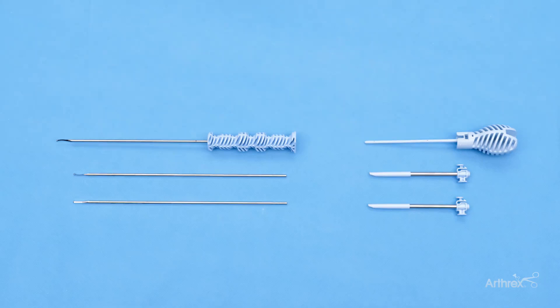This is Dr. Zach Farr with Tennessee Orthopedic Alliance out of Nashville, Tennessee, presenting the Safe Cut Capsulotomy Blade, one of the latest advances in safe access regarding hip arthroscopy.